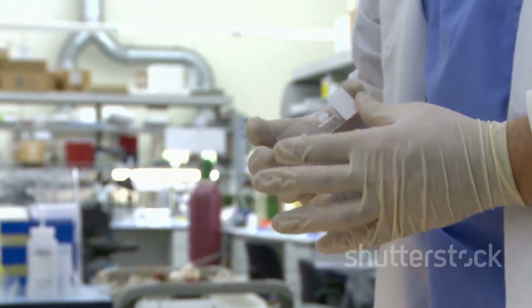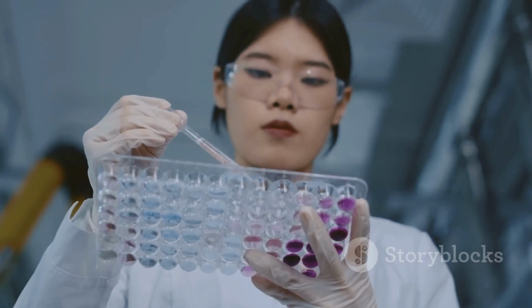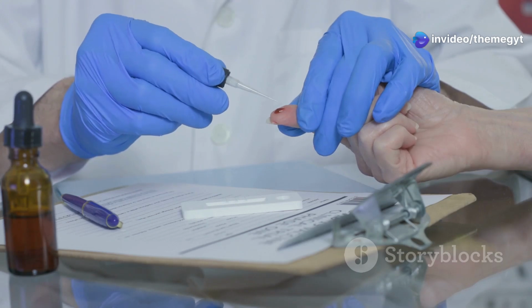In this technique, we use a special type of gel that contains the antibody. We then add a sample that might contain the antigen we're looking for. If the antigen is present, it will bind to the antibody in the gel.